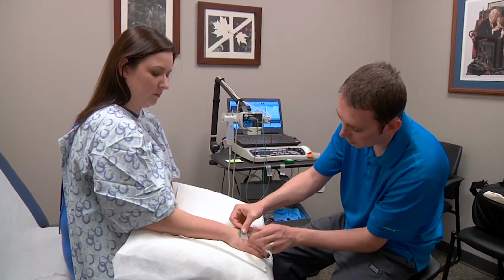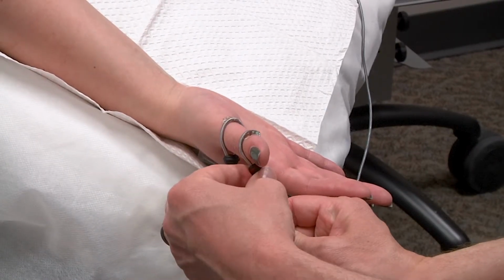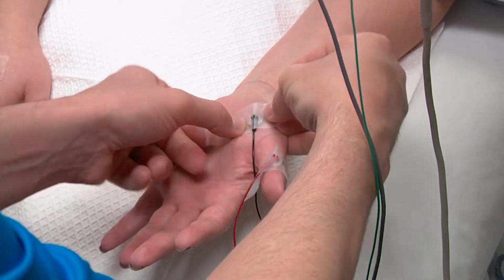And when we assess patients on clinical examination, we check their reflexes, we check their sensation, we check their strength, and look for the other clinical signs. What an electrophysiologic study does is that it allows us to further assess the nervous system to see where the problem may be coming from.